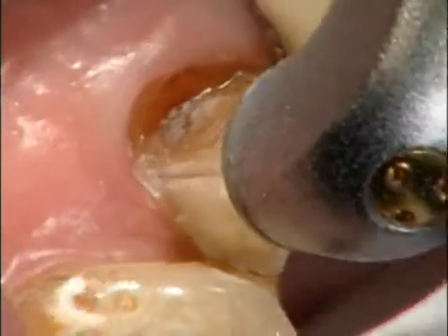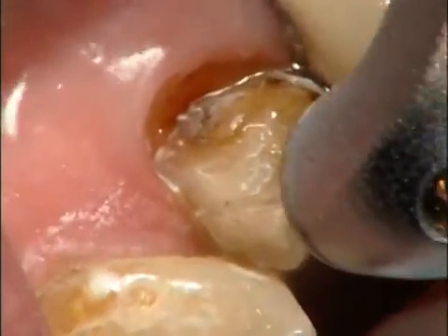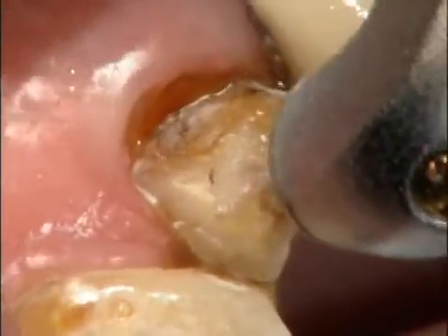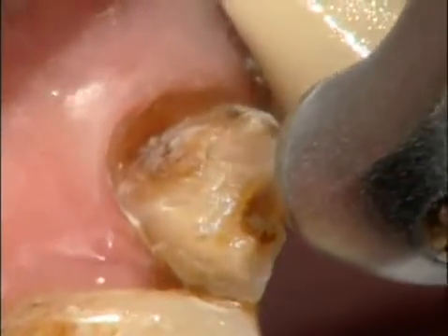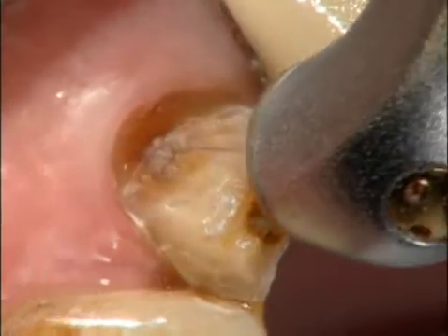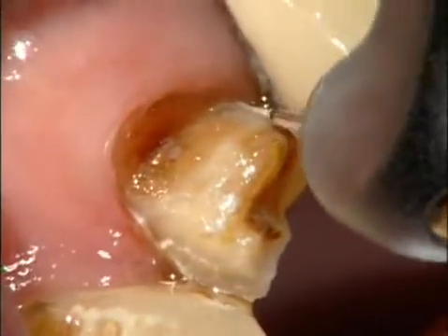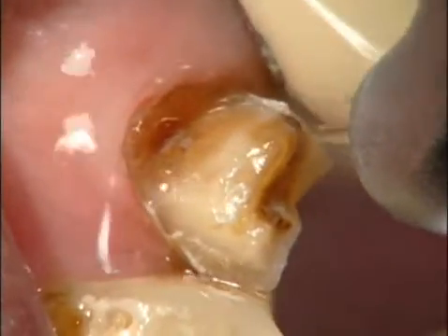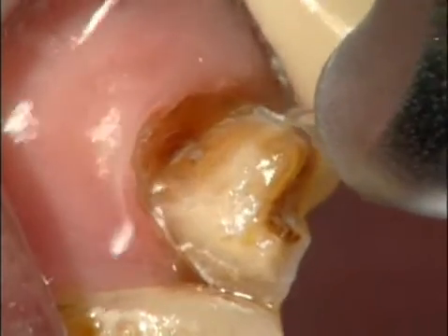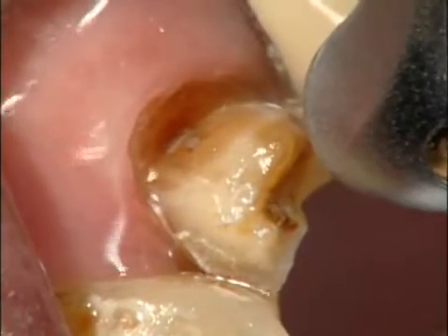So the reason I would use the laser to do a crown prep is medically, the patient is compromised. Dennis, his cardiologist, didn't want him to have any type of anesthetic. Some people are allergic to anesthetic. Of course, for some people, anesthetic doesn't work and the drill always hurts. So in those patients, I can work on their teeth without giving them anesthetic and without causing undue trauma to the tooth and, of course, the patient.